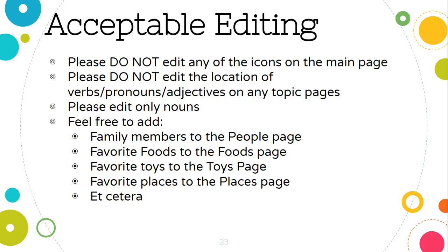We could chat and I can make some edits and then email it to you and show you how you would upload what I've done at my house to your child's device. And we have families who might send in some information on a Post-it note or might send an email. And we had a specific family who said, we really like to eat pork chops. Could we please add the pork chops to the dinner page? And then we quickly went in and did that before he went home that day. So we can easily help make some of those additions for you if you're feeling like this is something you're not ready to tackle right now. That's absolutely fine. So again, feel free to email me if you have any questions about this or want any help getting some things edited for your child.